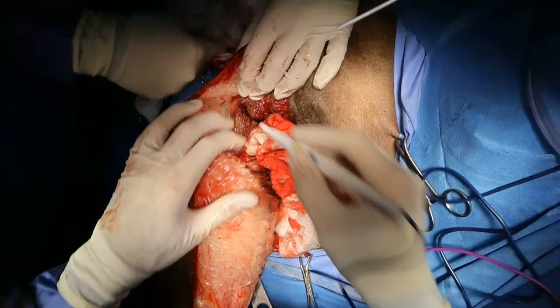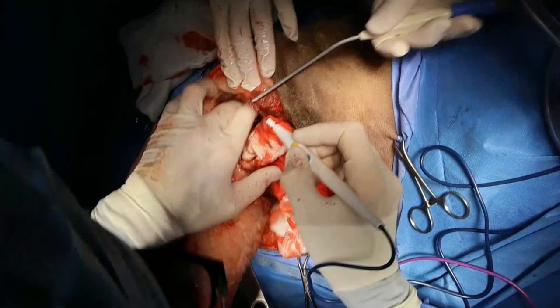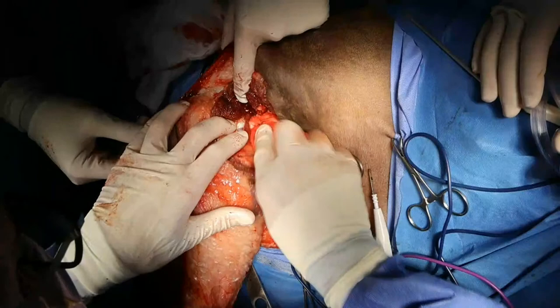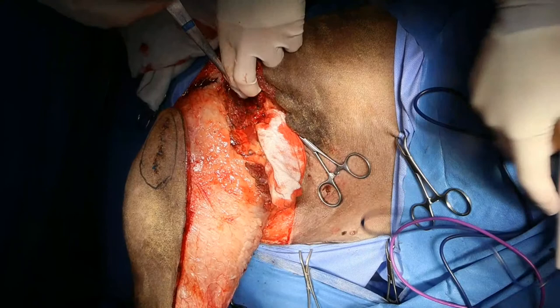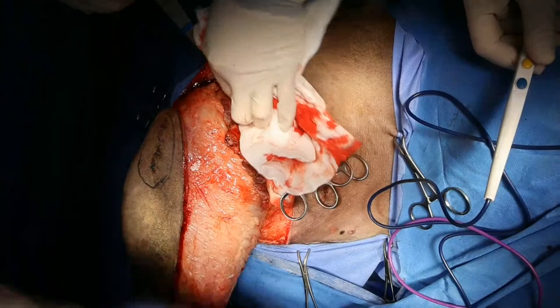So the exact location of the tumor is the proximal femur, femoral neck, and getting up into the acetabulum. All right, so now what I'm going to do is I'm going to pack one sponge in here. And then I'm going to get a Hohmann and come around the top of the ilial wing there. Can I get a periosteal elevator, please? Thank you. So now I'm looking at ilial wing, and you'll see that when I cut that, all of a sudden the leg's going to release.